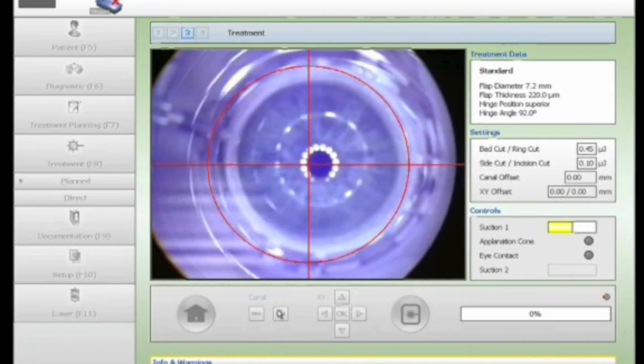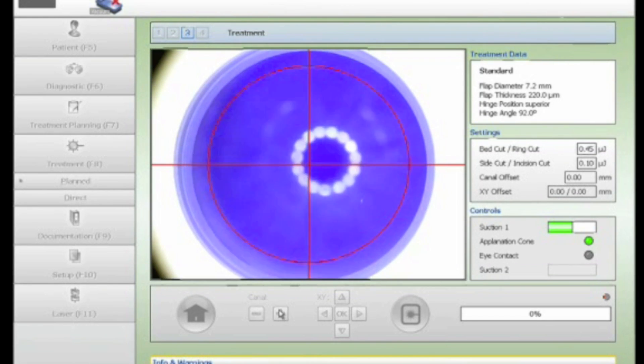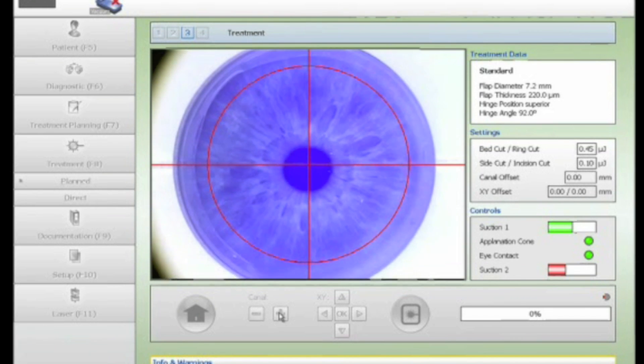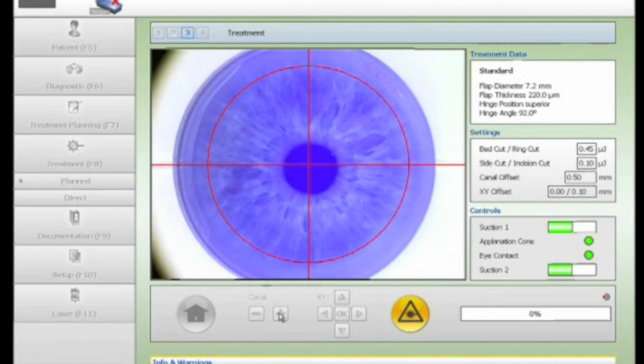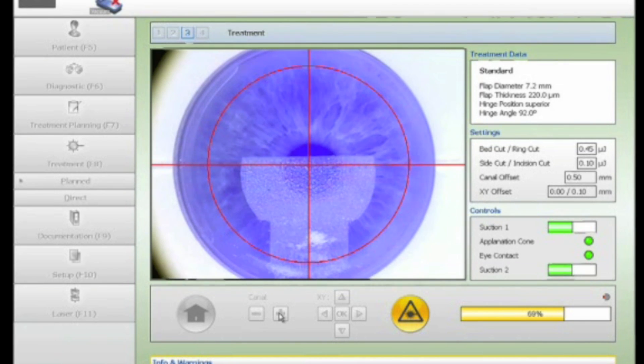Excess bubbles are removed by gently irrigating under the flap again without disturbing the inlay. Now a Femto Pocket is going to be created. Pocket software is not currently available on the FS200; therefore, customised adjustments on the current software are used to create a pocket. The flap dimensions have been changed to include a much wider channel and a smaller diameter flap of 6mm. The edge cut is reduced to 0.1 µJ, which means that no edge cut ensues and we now have our pocket.